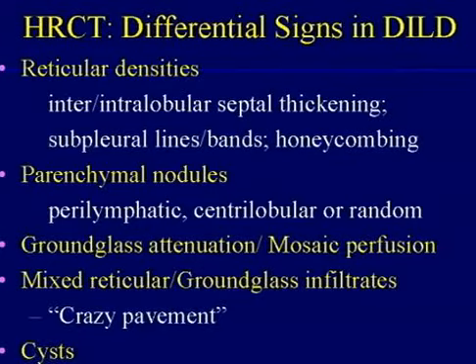And then one other thing to talk about in terms of technique, and that is low-dose CT. Because if you're really talking about trying to evaluate the lungs, especially if you already have somebody who's been evaluated with a good quality study, you can cut the MA down to 30 to 40 easily without sacrificing any detail in the lungs.